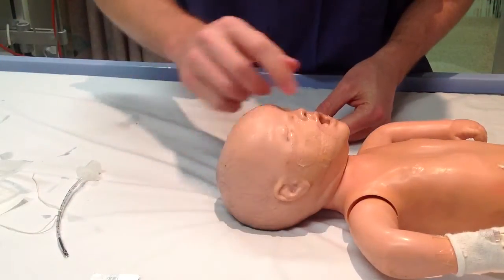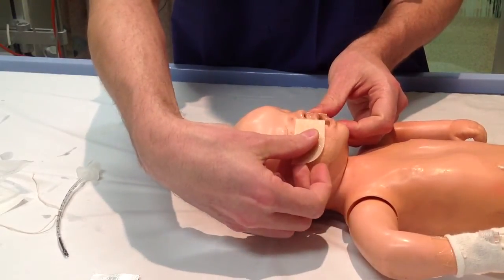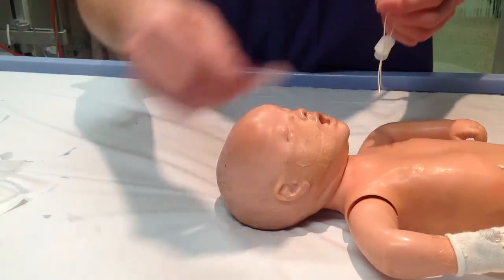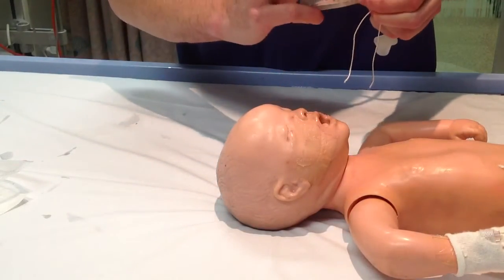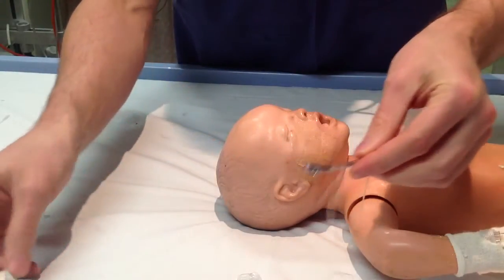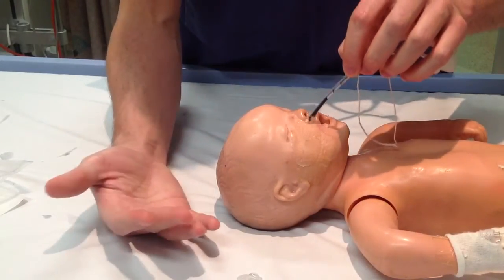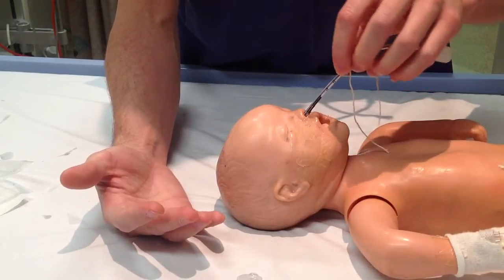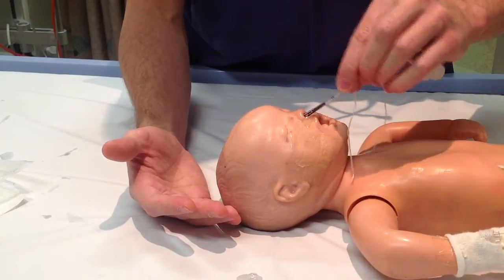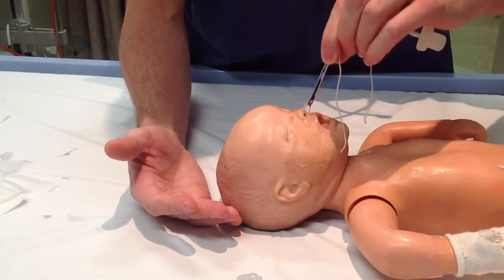The next step is to make sure that the patient's cheeks are dry and clean, and then the Duoderm or Cumfeel is placed. This patient often has it on already. When inserting the tube, it's very important to use a lot of lubrication — at least a sufficient amount to minimise the risk of bleeding or trauma. The principle with any nasal airway is gentle, constant downward pressure — directly down, not angled up, but directly down. If it doesn't go easily in one nostril, you can always try the other.